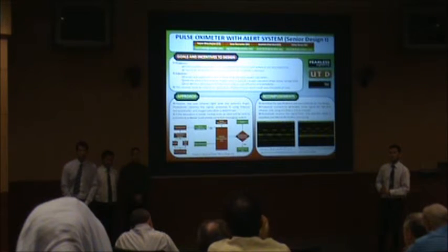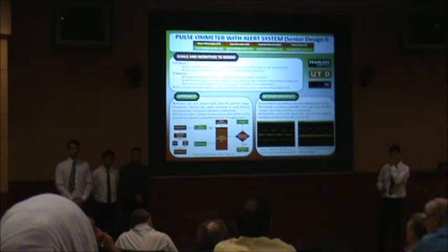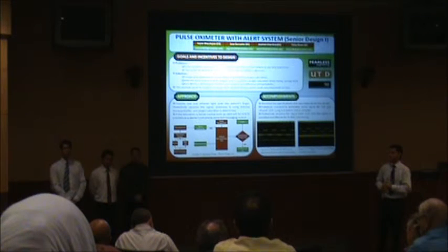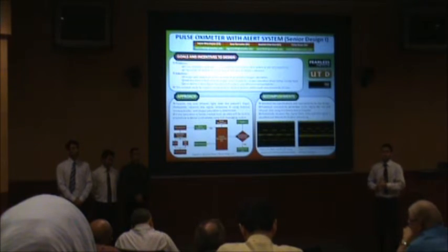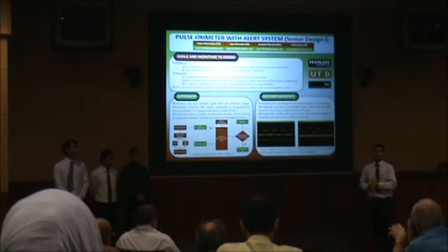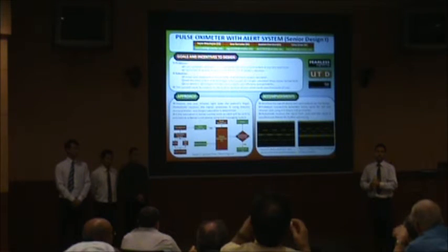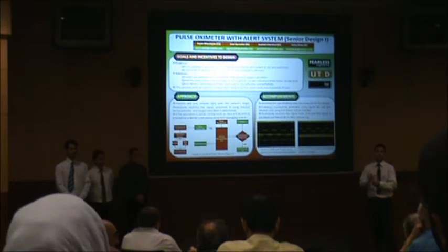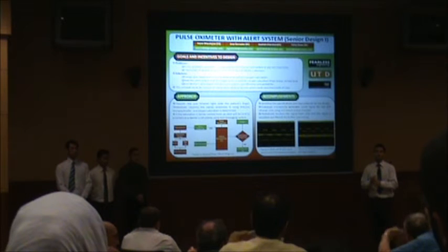Are you planning for a wireless oximeter or a wired one? For the data processing, it is wired to integrate with the microprocessor. From the microprocessor to the cell phone, what kind of transmission? Bluetooth? No, actually it will be a text messaging system. We are using an Arduino microcontroller with a GSM shield. We will have a regular working SIM card on it, and it can transmit text messages from there to anywhere. So you have a cell phone subscription that you sign up for.